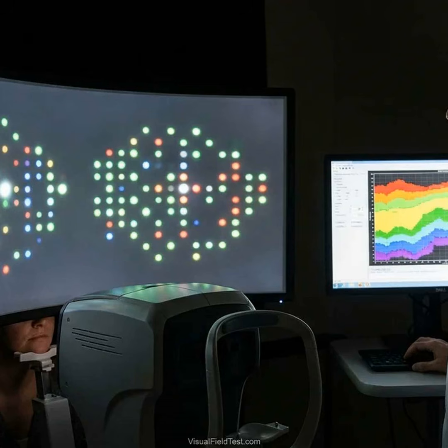Introduction. Vision relies on many kinds of retinal ganglion cells, RGCs, each tuned to different color or contrast signals. Standard visual field tests use white-on-white, achromatic stimuli and measure overall sensitivity, but early or selective damage in diseases like glaucoma can hide behind normal full-field results. Specialized perimetry tests now probe specific pathways by using color or temporal contrast stimuli.